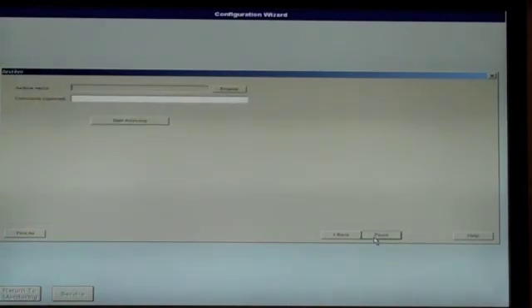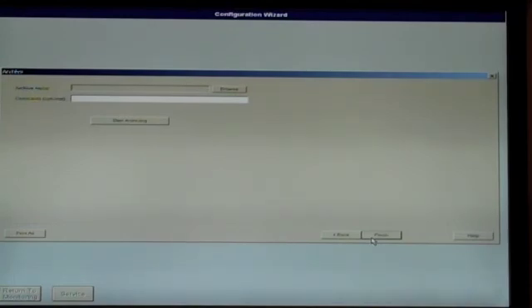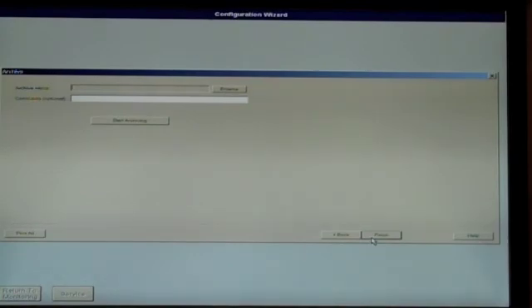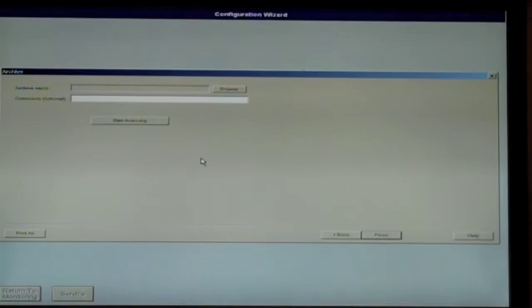At the archive screen, you can create a floppy disk backup to store all of your system's purchase options and settings. If your system did not come with one, it is highly recommended that you create one by using a floppy disk in Drive A, then click Start Archiving and follow any system prompts. Once that is done, or if you are not creating one at this time, click Finish.